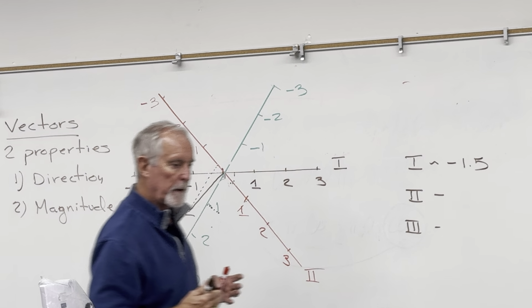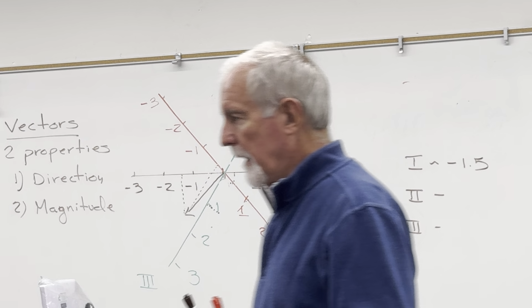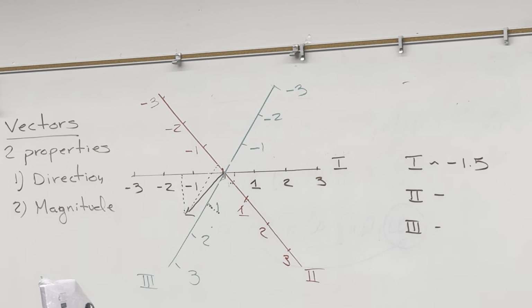So coming back, the way you explain that I've got exactly the same electrical event, and yet it's producing entirely different waveforms in different lead systems, is because what we're really looking at are vectors. Okay?